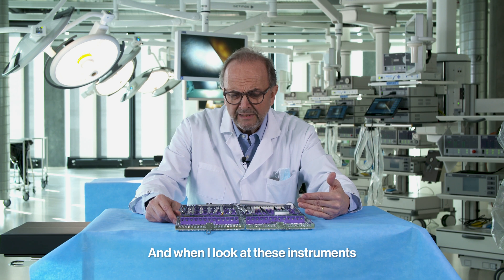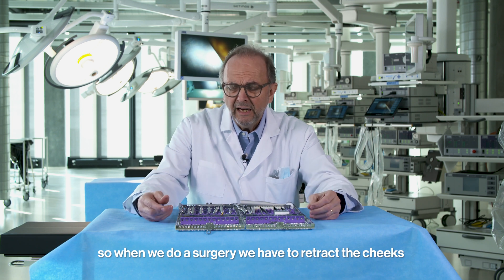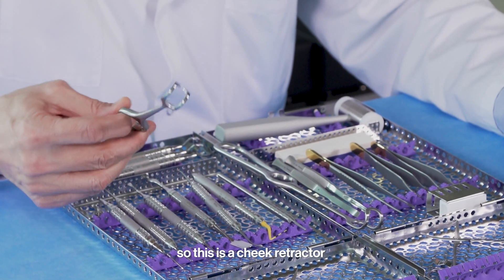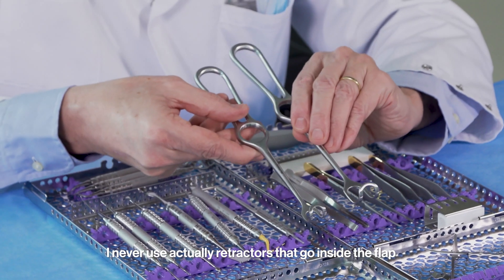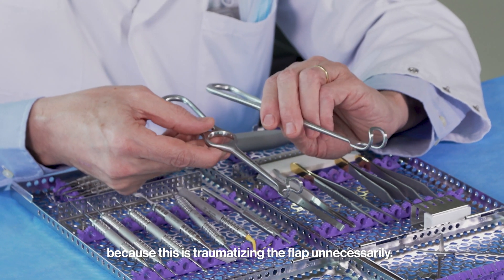Let's start from the outside to the inside. When we do surgery, we have to retract the cheeks. In German we call them window hooks. This is a cheek retractor — a very fine one — and this is a larger one. I never use retractors that go inside the flap, because this traumatizes the flap unnecessarily.